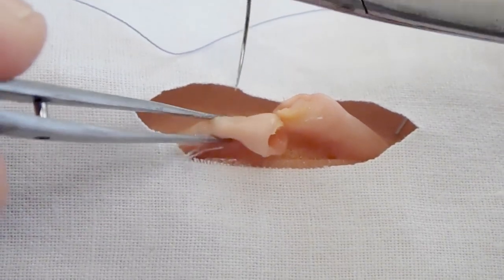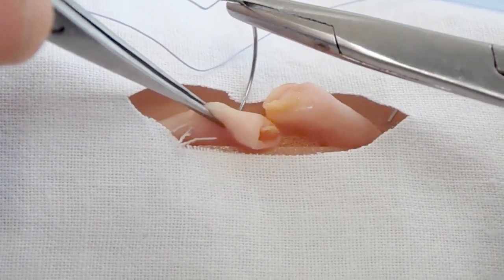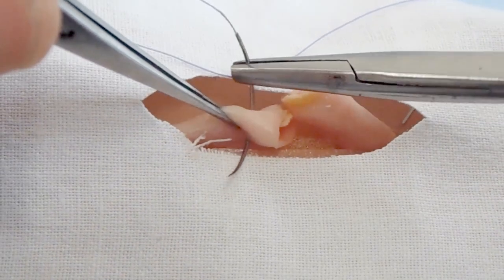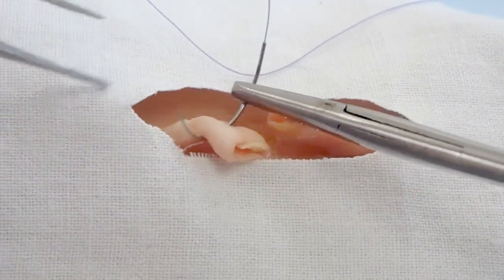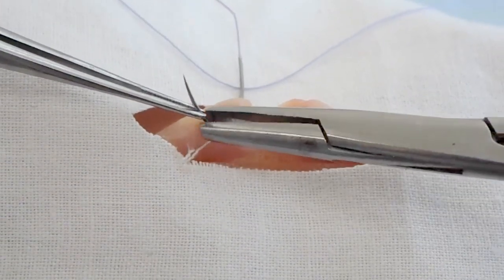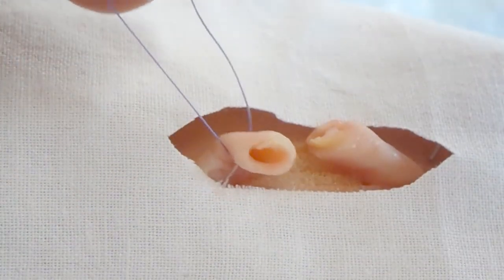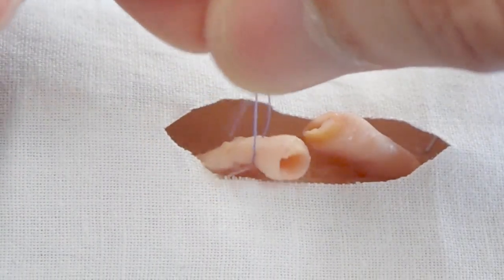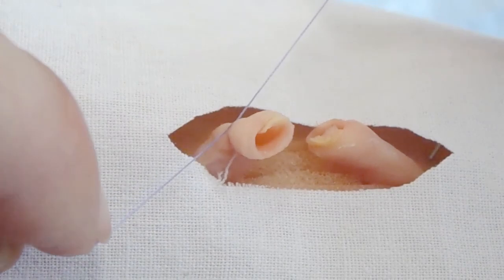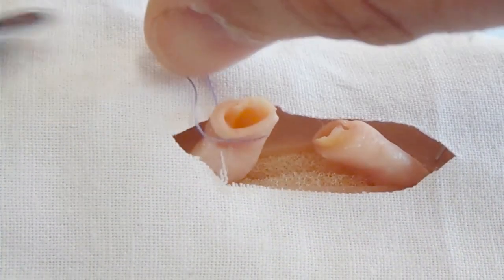Ligation with suturing is performed on the central end of the vessel, separated from the fascia, for prevention of filament loss. The vessel is sutured through its diameter with an atraumatic needle at a distance of 1 cm from the end. A surgical knot is made on one side of the vessel, after which the filaments go around the second half of the vessel and a simple knot is made.